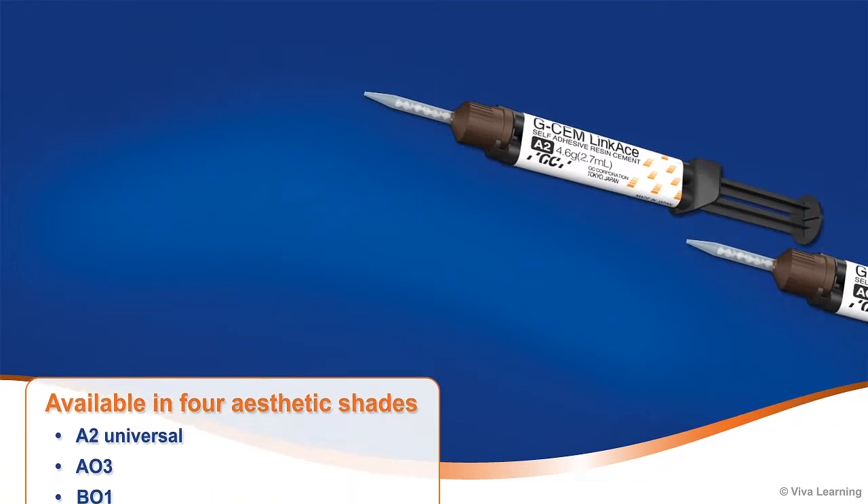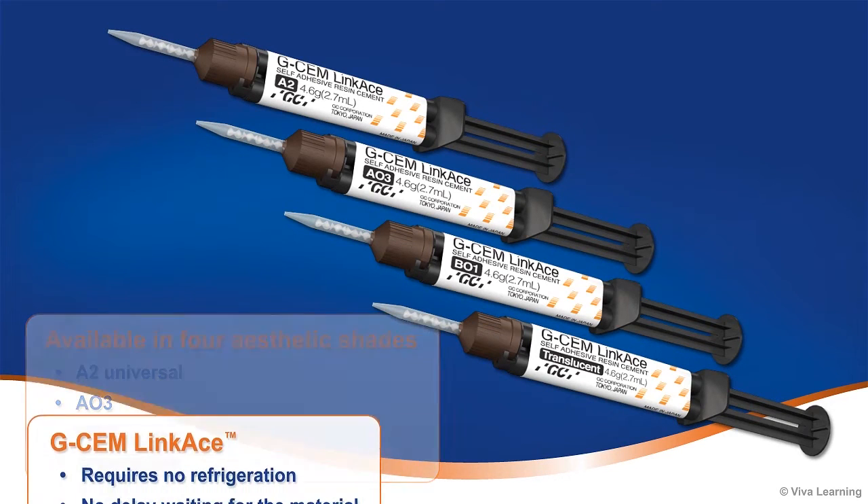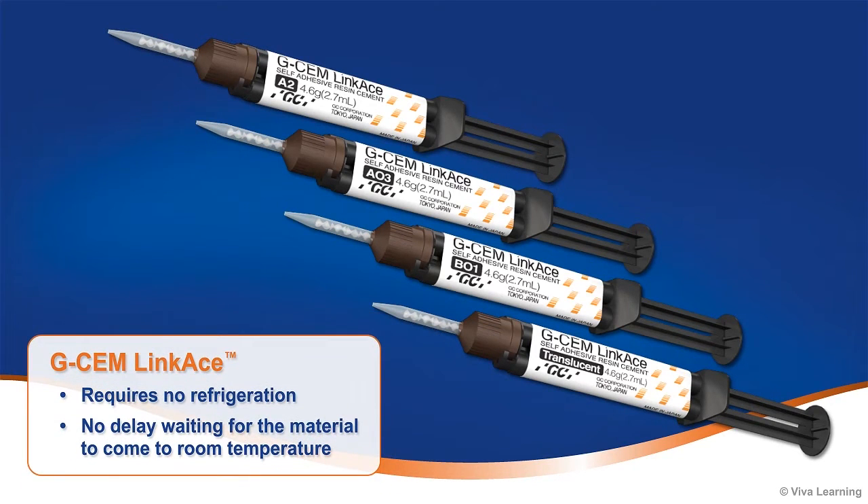Available in four aesthetic shades — A2 universal, A03, B01, and translucent — GCem LinkAce requires no refrigeration, so there is no delay waiting for the material to come to room temperature.